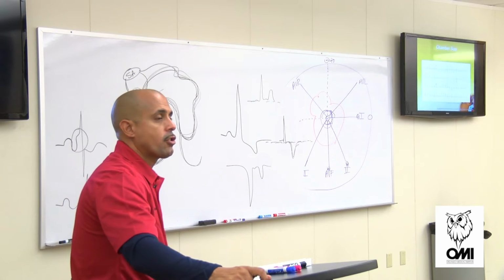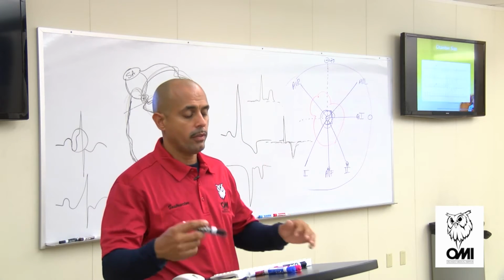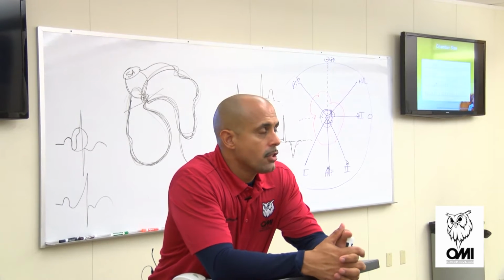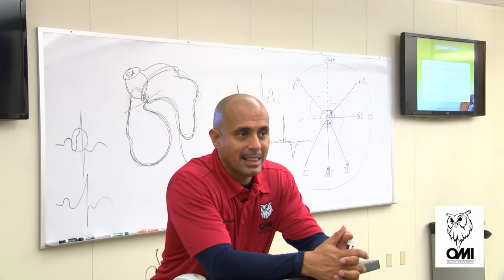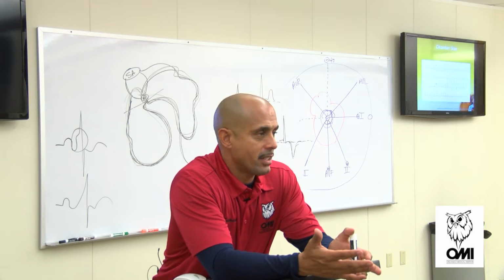So we're talking about the left ventricle. What leads on the 12 lead look directly into the left ventricle? 4, 5, 6. So what leads would I want to use to determine if I got a tall R wave, that looks directly at the left ventricle, that I'm trying to identify left ventricular hypertrophy? 4, 5, 6, especially 5 and 6.